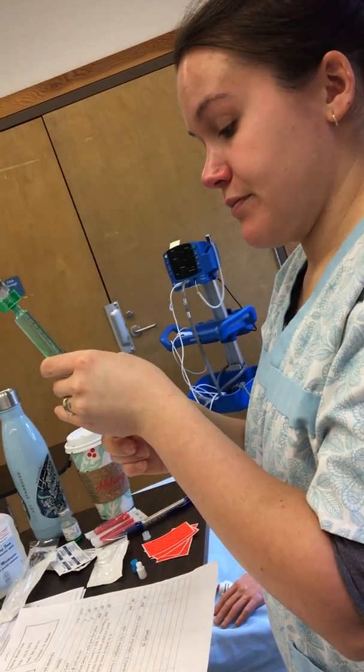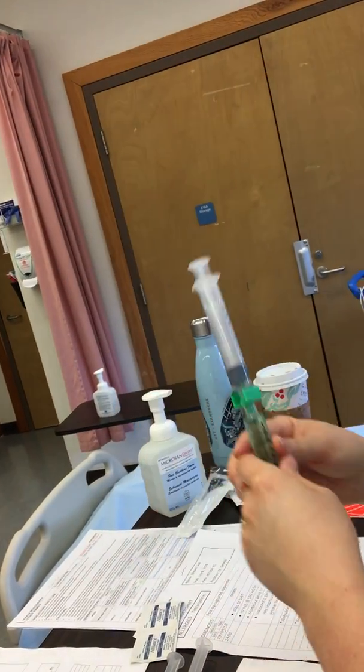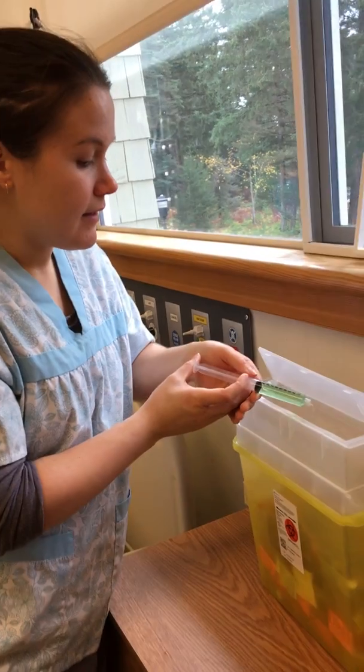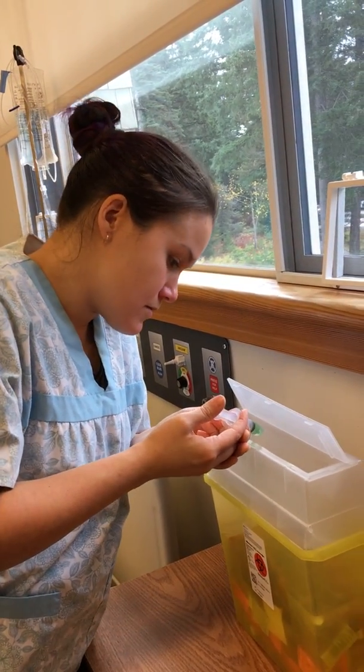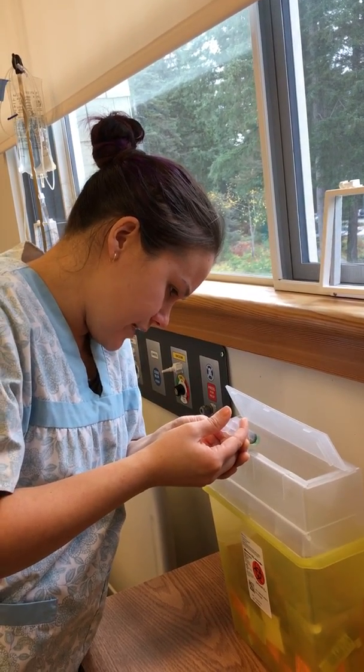So now I've pulled back to get 10 milliliters, which means that my medication is sufficiently diluted. So now with another nurse present, I'm going to waste 8 milliliters into the sharps or another appropriate receptacle.